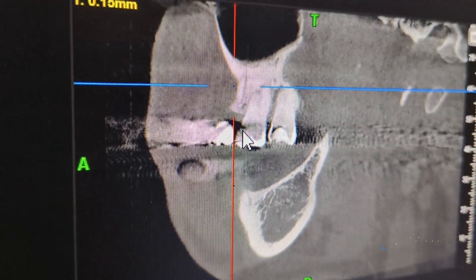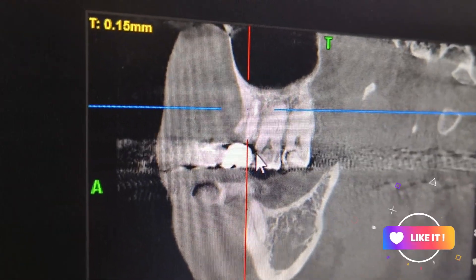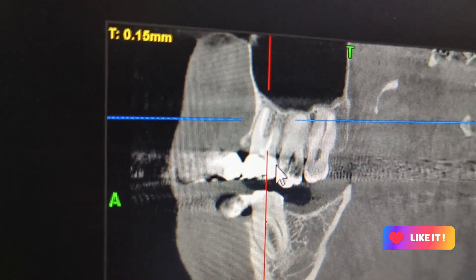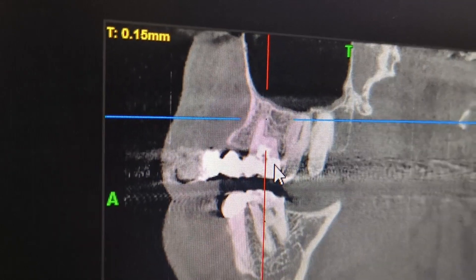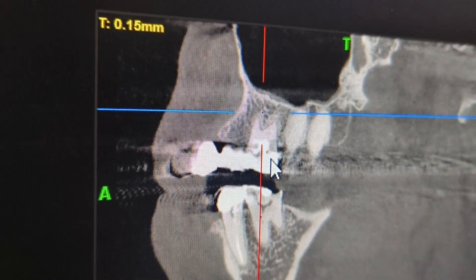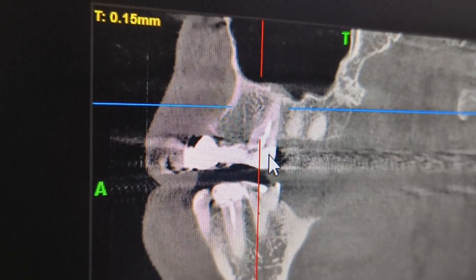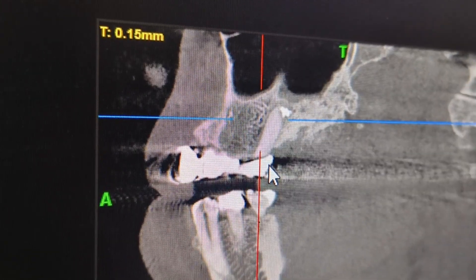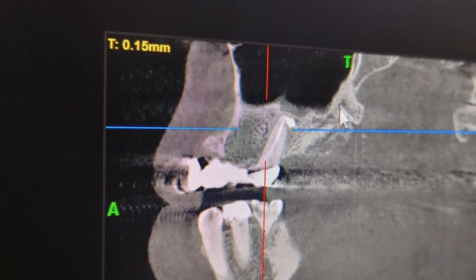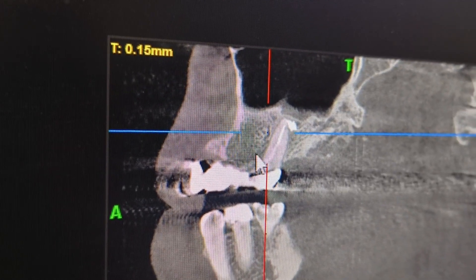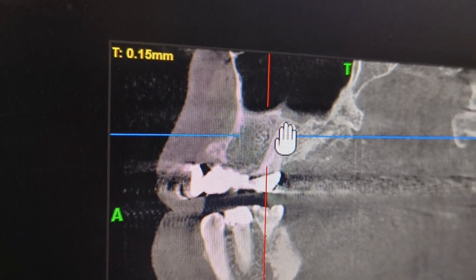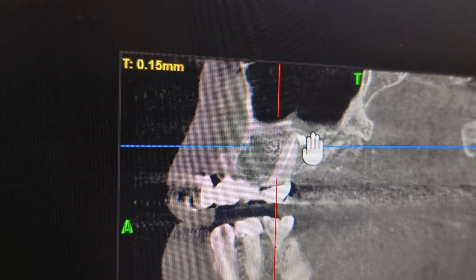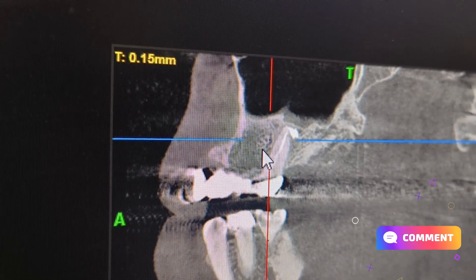I'm scrolling with the mouse. We are going more palatally now and we can see the palatal root here. There was some infection which has healed due to the placement of a good quality calcium hydroxide.